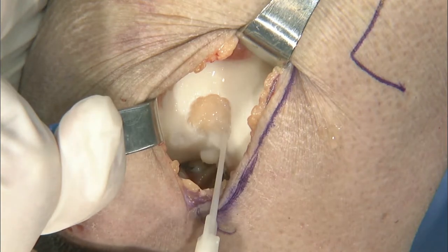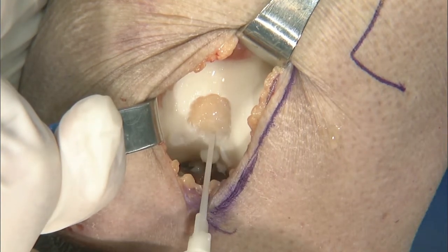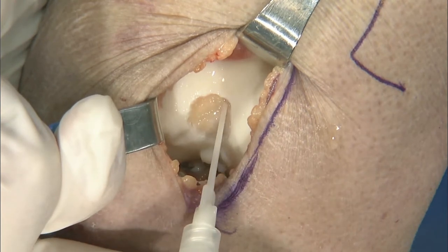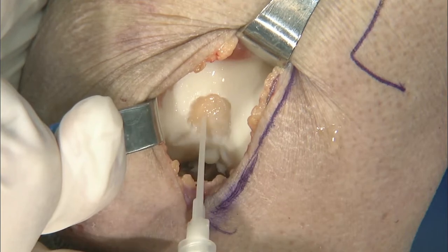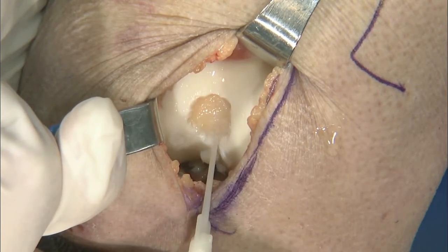You don't want it to be gobbing down. You don't want it to be running over. The idea is to hold the implant in place, but not really to adhere to anything else around it. So I like to describe it as kind of painting that defect. As you're painting that defect here, I can see that it's all nice and shiny.